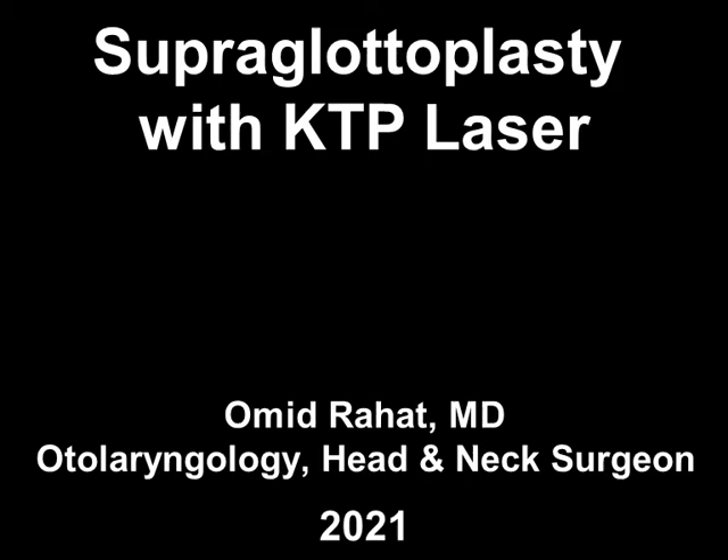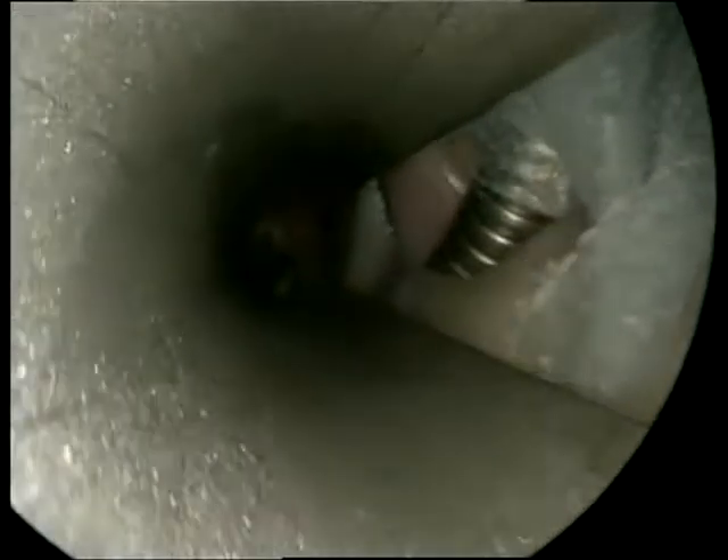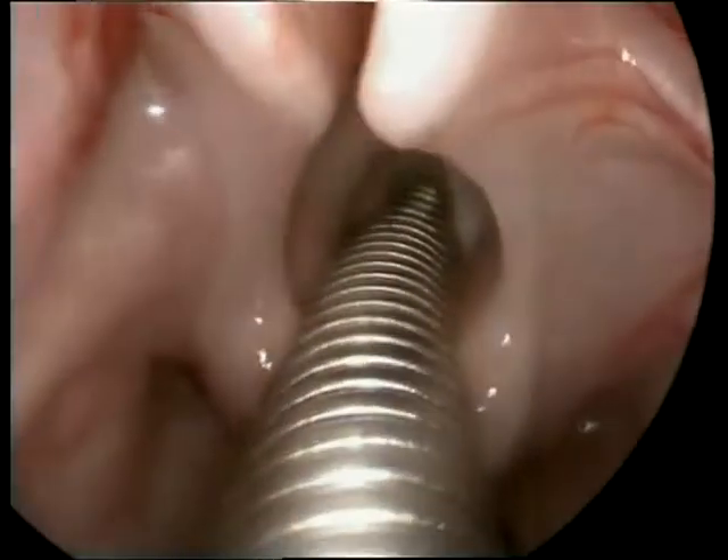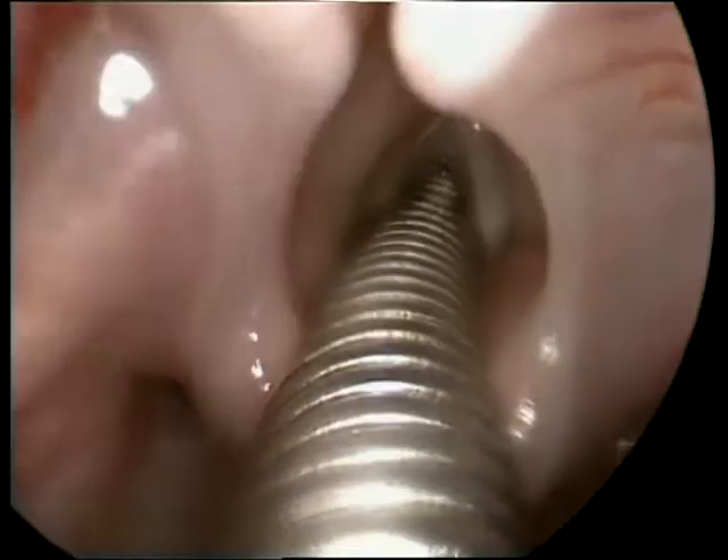Hi, this is Omid Rahat, otolaryngologist, head and neck surgeon. In this video clip, we're going to see a case of laryngomalacia and how I managed using a KTP laser to perform the so-called supraglottoplasty.